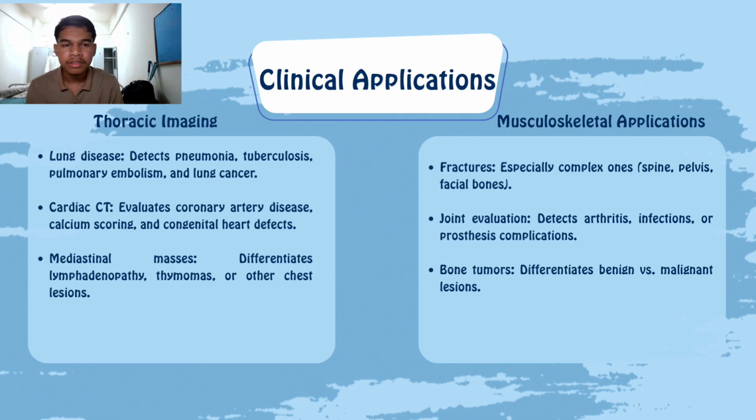And the second clinical application is musculoskeletal application. It can detect fractures, especially complex ones, such as the spine, pelvis, and facial bones. And then for joint evaluation, it can be used to detect arthritis, infection, or prosthesis complications. For bone tumors, it can differentiate benign versus malignant lesions.